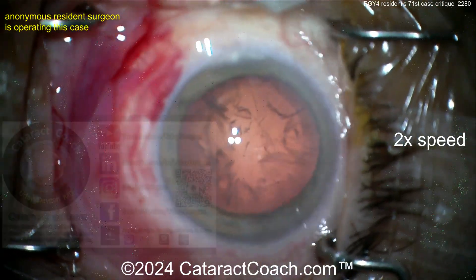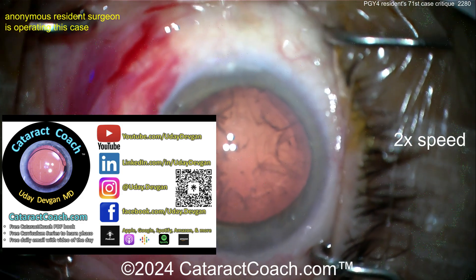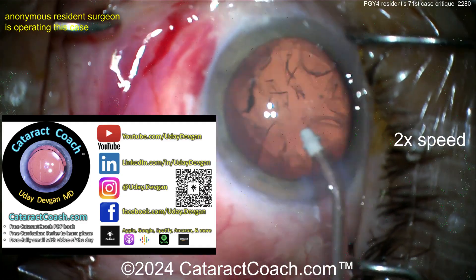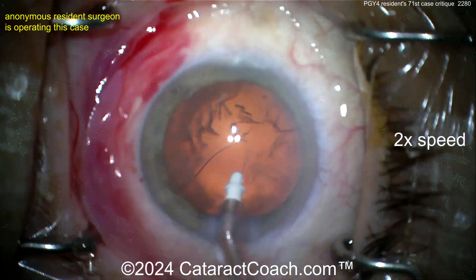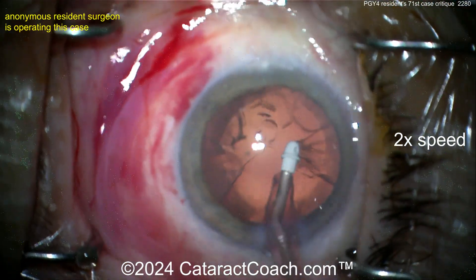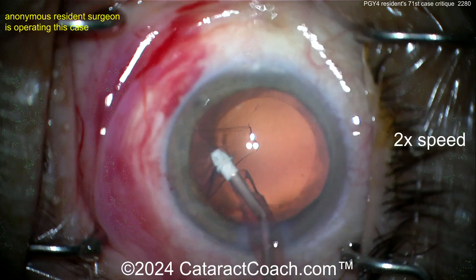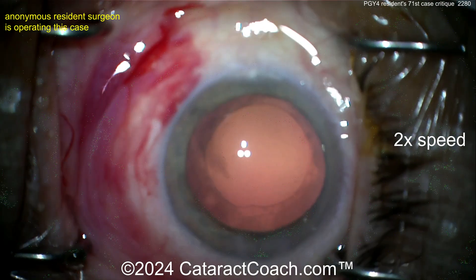Don't lose the infusion — watch for that. Check out the podcast every week for secrets to success. Now cortex removal — looks like a soft polymer tip coaxial IA. Take it out of the cortex nice and easy. Instead of stripping radially a little bit at a time, try going circumferentially — that's the technique to work on.